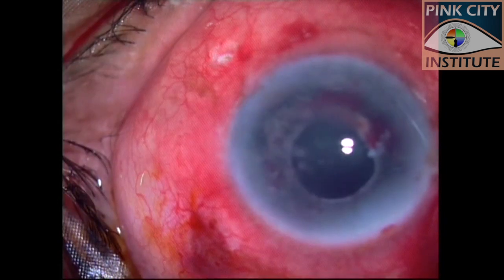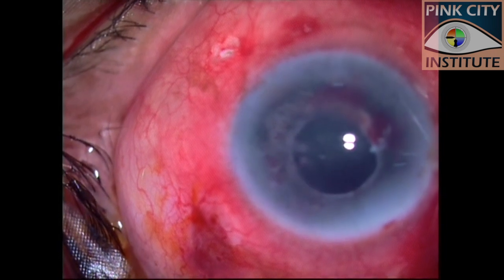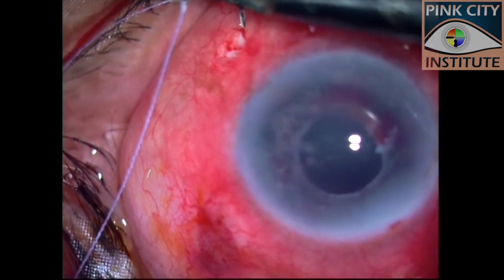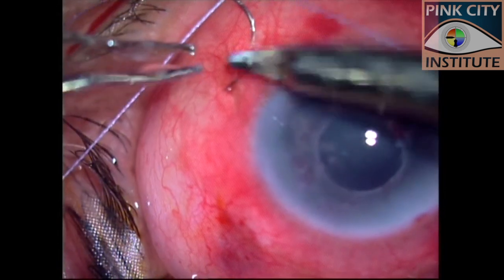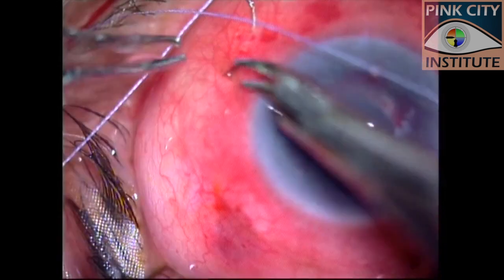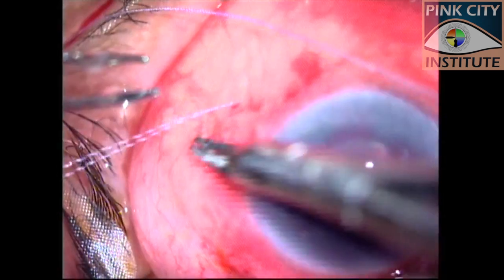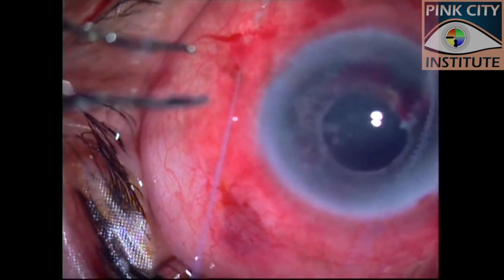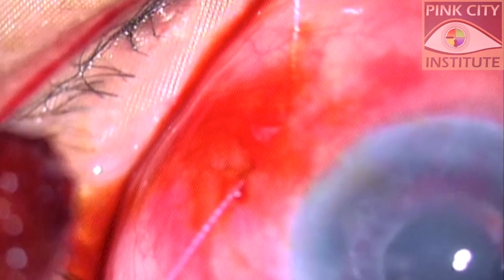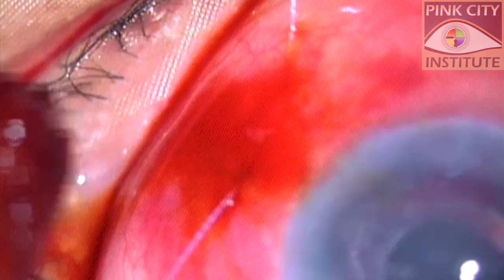A decision was taken to employ sutures to secure closure. 7-0 polyglactin or Vicryl sutures were passed transconjunctively through partial-thickness sclera. Intraoperative Seidel's test was performed with povidone iodine over the sclerotomy and no leakage was confirmed.